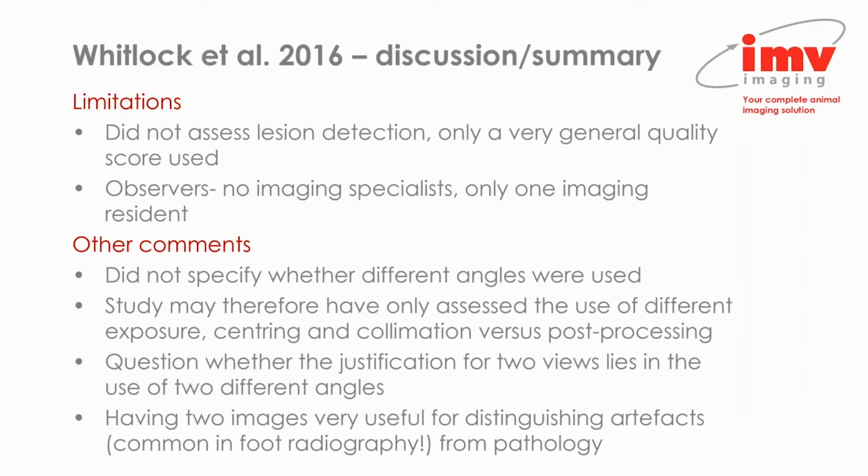Other comments: the paper didn't specify whether a different angle was used for each of the views. As I said, usually between the upright pedal and the upright navicular view, as well as having different centering and collimation, each would be acquired at a slightly different angle. And so we do not know, based on this study, whether they used different angles or not.